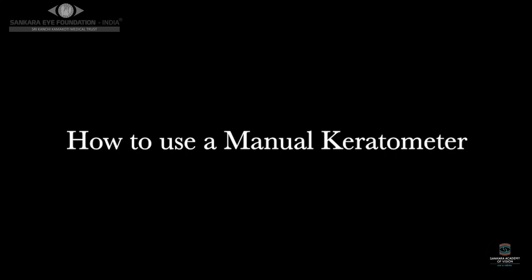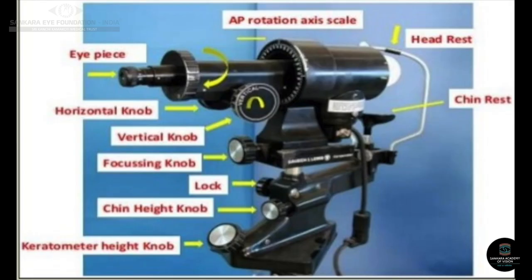Now we come to demonstration of how to use a manual keratometer. These are the parts of a manual keratometer. We can see the eyepiece, which is used for focusing. Then the chin height knob, the headrest knob, the chin rest, and the headrest where the patient aligns himself. Then the keratometer height knob at the bottom to adjust the mires over the patient's cornea. Then the focusing knob to exactly align the mires, and thereafter the horizontal and vertical knobs to align the axis in both meridians, along with the anterior-posterior rotation axis scale for oblique or irregular astigmatism.